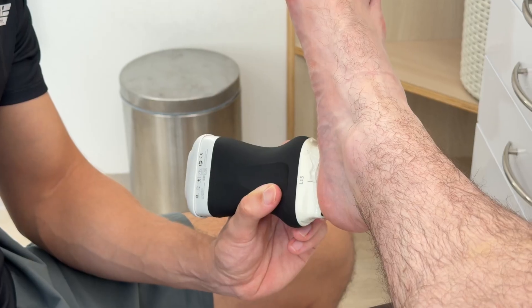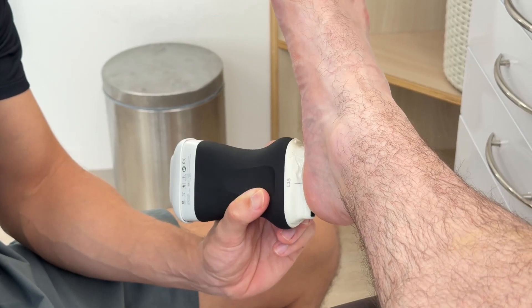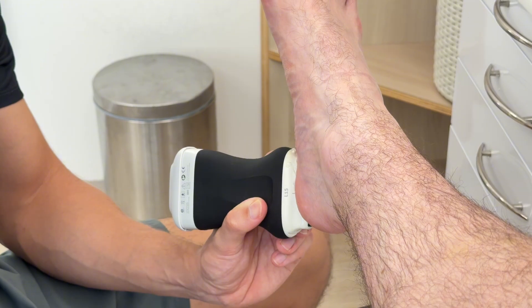If you're a clinician who's considering getting a handheld ultrasound, I would recommend getting the ultrasound before you go on a course. Because what can happen is you go on a course, you learn some things, but if there's a gap between your course and then actually using the transducer, you're going to lose those skills.